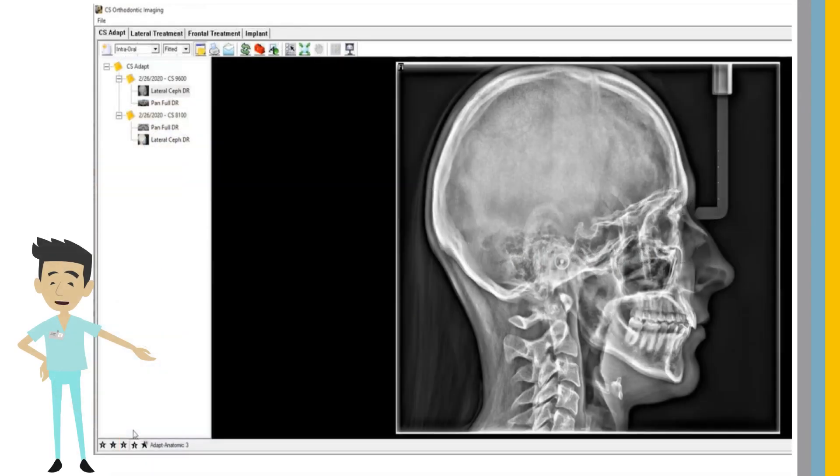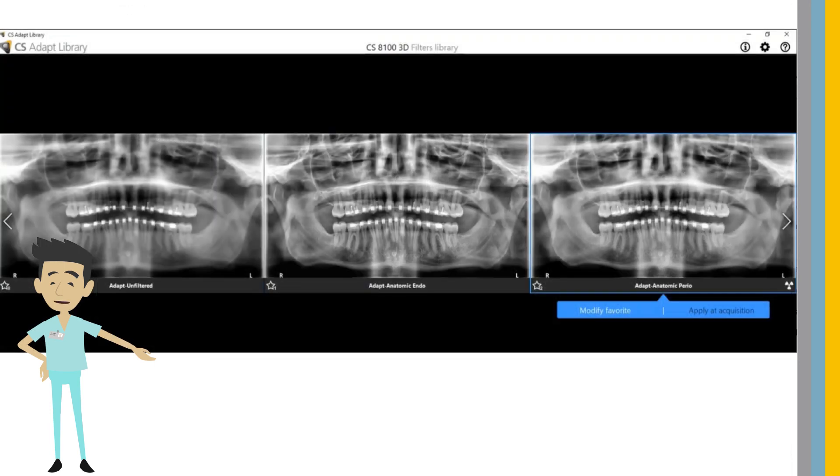Improved CS-Adapt image filters are available for images acquired with the CS8100 and CS9600.